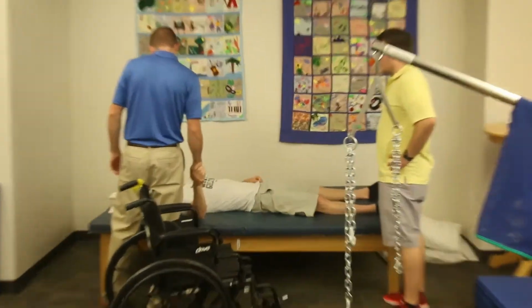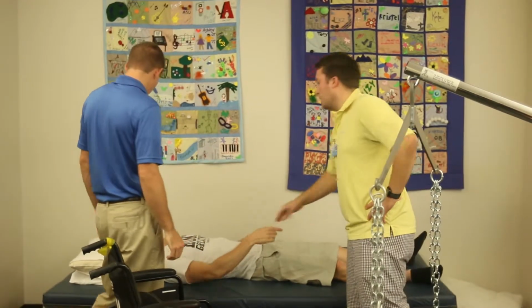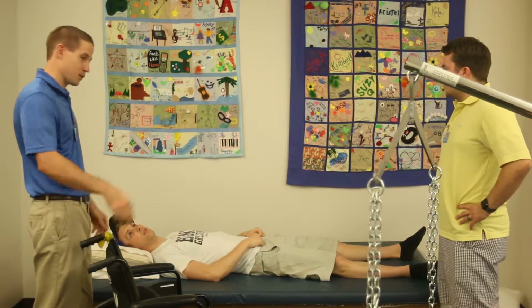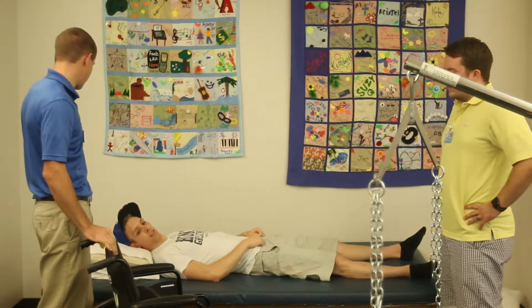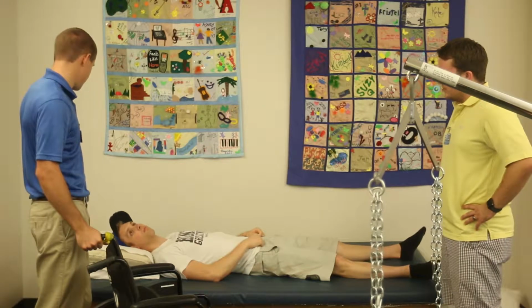Good. I'm Dylan. I am a student physical therapist. This is Rich. He's my aide. Nice to meet you. What we're gonna do today, we need to get you into your wheelchair, but in order to do that, we're gonna use a hydraulic lift to lift you up out and get you in the chair. Is that okay? Mm-hmm. Perfect.